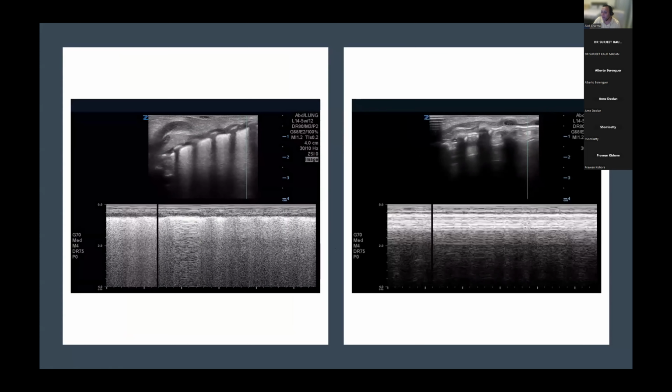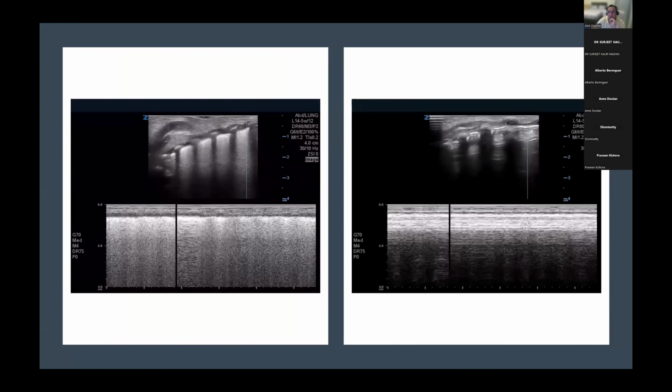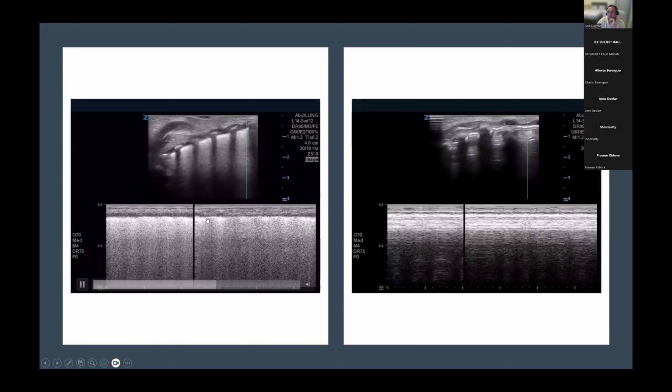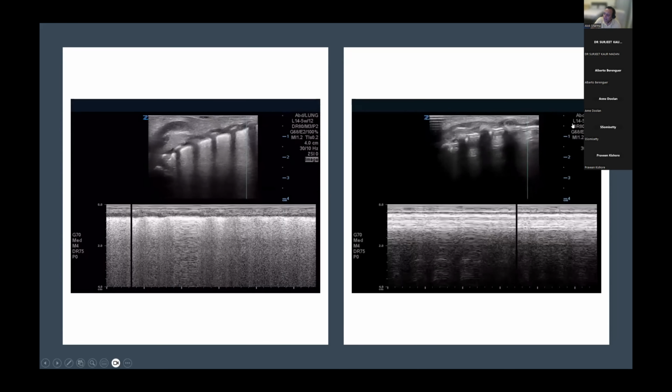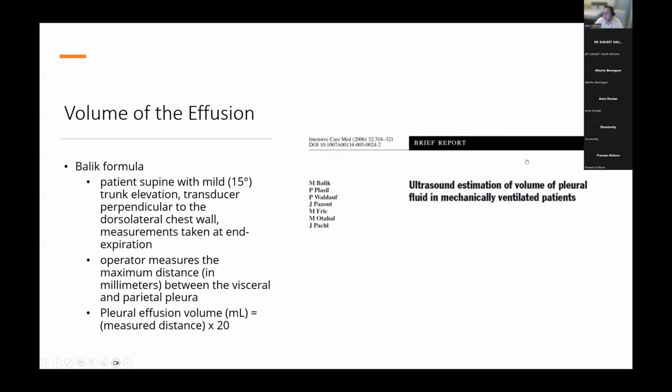But more importantly, from our perspective, if you were to do a tap and your baby were to develop significant respiratory distress, you can go back with the ultrasound in real time and diagnose a pneumothorax, as you can see over here. So really, this is a baby who developed a pneumothorax in real time. It's not one where we put a drain in. This is just an example of a baby who has a B profile and has developed pneumothorax, but this could well be a baby where you've done a tap and really you'll get the answer.